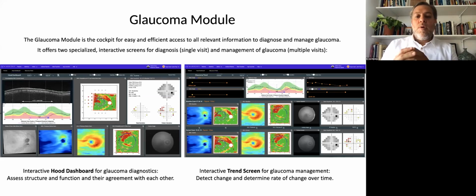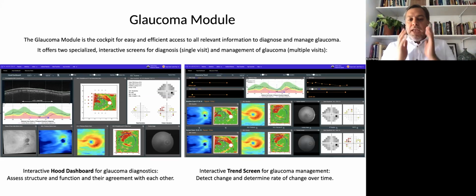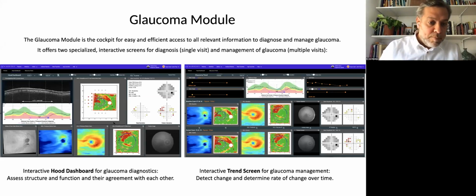In this glaucoma model, we are working with this topographic widefield analysis. And these address the major concerns that we have with the prior reports. The first one: how do we avoid head rotation or any sort of artifacts? The software takes this into account, and we can assess the correct position of the blood vessels and have the correct positions of the scan to avoid these types of misalignments and errors during the diagnosis.